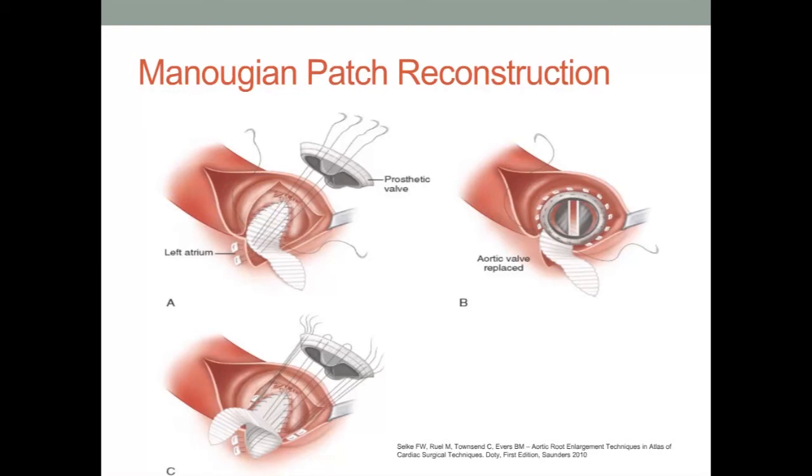and in particular repairing the defect in the anterior leaflet of the mitral valve with the patch using interrupted or continuous sutures without pledgets. At the level of the aortic valve annulus, interrupted sutures with pledgets are placed and passed first through the patch and then through the prosthetic valve. Remaining valve sutures are placed through the aortic annulus in standard fashion. Once again, if the left atrial wall is flexible and the defect is small, it can be approximated directly to the patch material. Otherwise, a second patch is fashioned to reconstruct the left atrial defect.